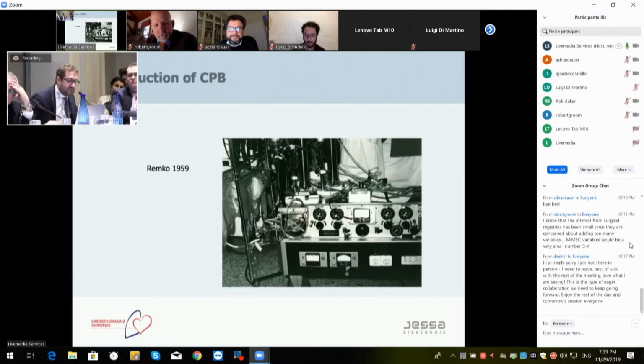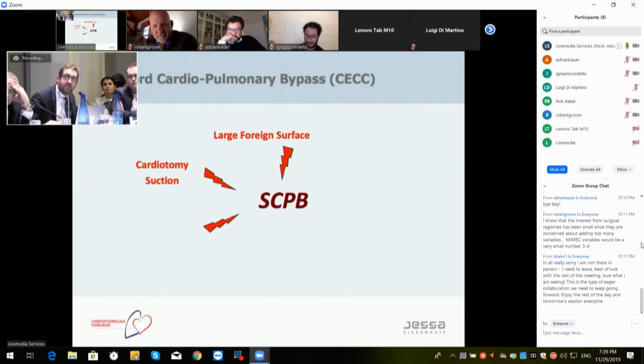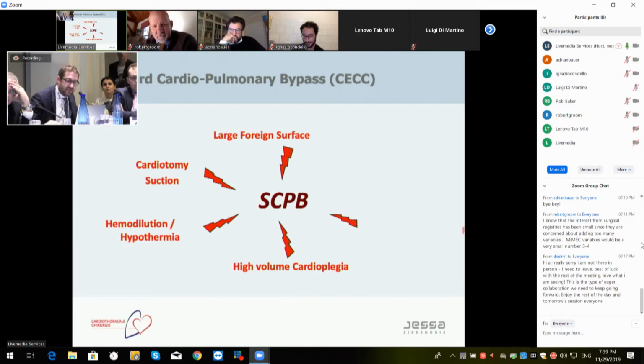So first I will start with the introduction of CPB. Everybody shows nearly only Gibbon. He was a few days later, but still we came a long way. Also, we all know the drawbacks of conventional extracorporeal circulation, and we try to avoid that.